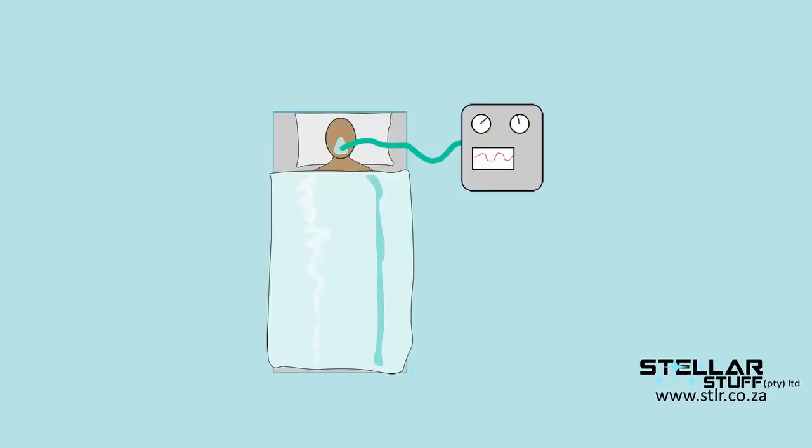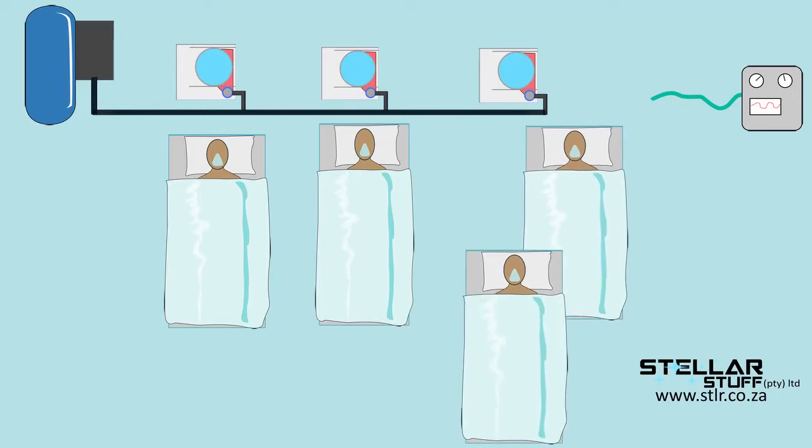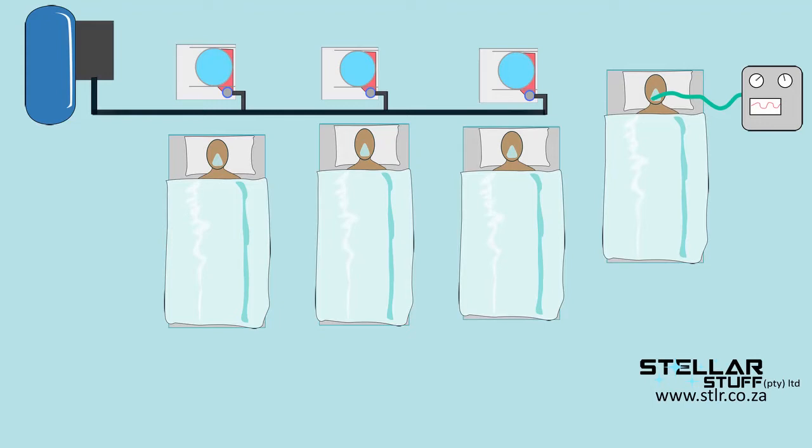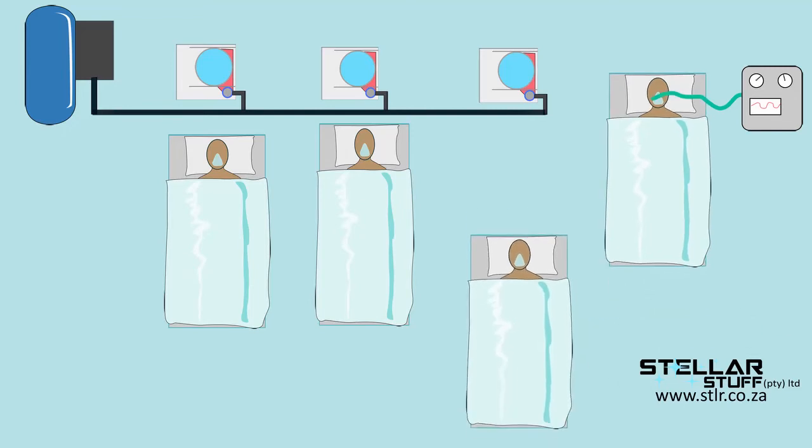This ventilator is not designed to replace more advanced electronic ventilators that can do automatic monitoring and adjustments to individual patients. It is designed to offer more triage time for medical staff, stabilizing patients that are critical so that medical staff can choose which patients are supposed to go on the more advanced machines or not. When patients have recovered enough but still require breathing assistance, they can be moved back to this mechanical ventilator.